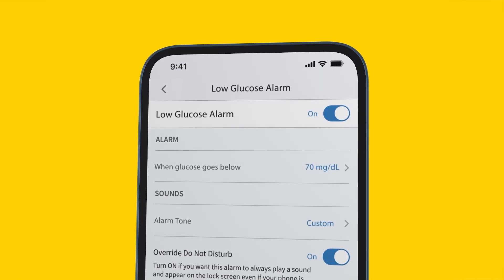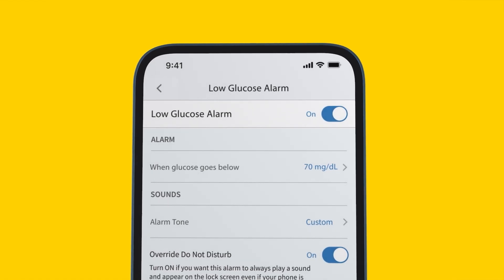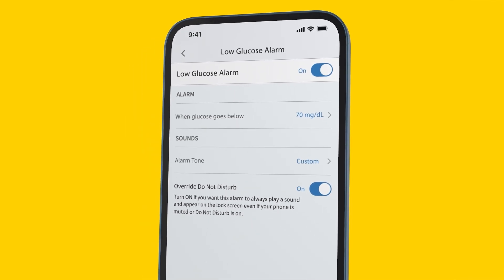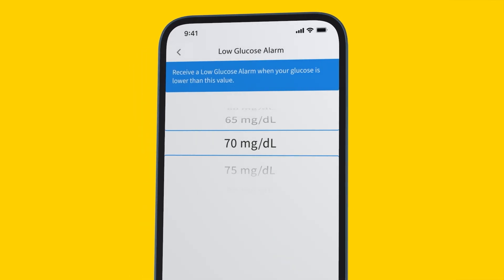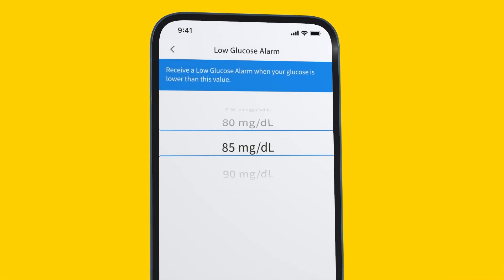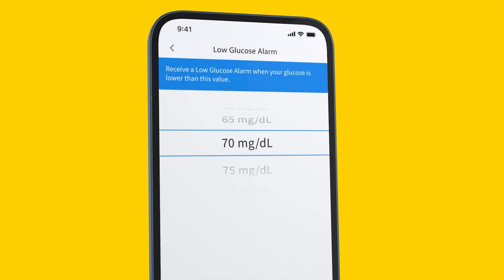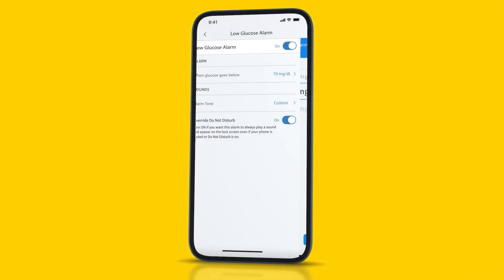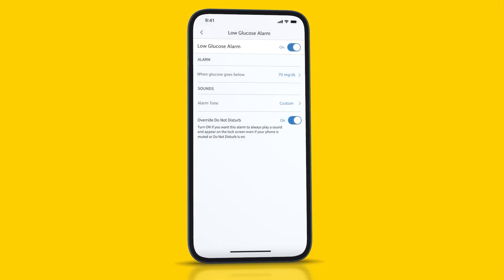The low glucose alarm will be set to ON by default. Next, set the low glucose alarm level. Touch the arrow to get to the next screen, then scroll up or down to select a low glucose value. My doctor and I have chosen 70 milligrams per deciliter. Once you've chosen your glucose level, save it.